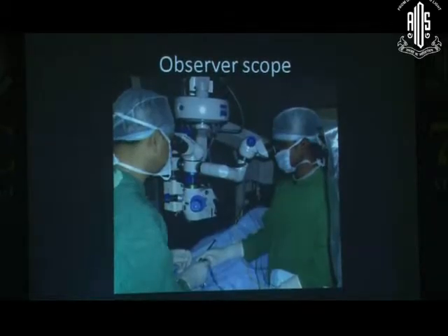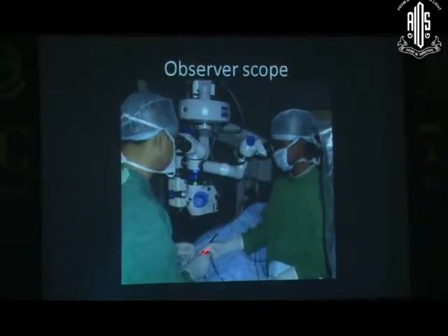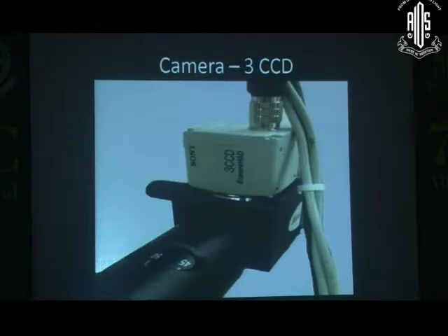Now, why an observer scope? Because your assistant in retinal surgery is an important person, and we at our hospital use a handheld wide angle contact system, and this is handheld, and this gentleman here is the most important cog in the wheel. Unless he can see the retina clearly, you can't manage your surgeries well and your recordings well.